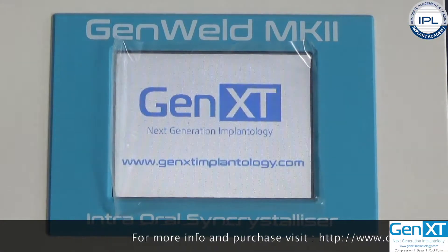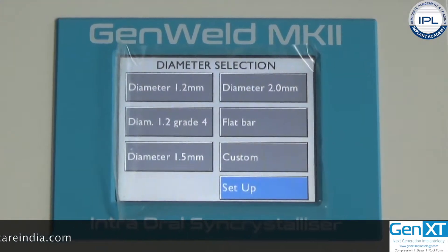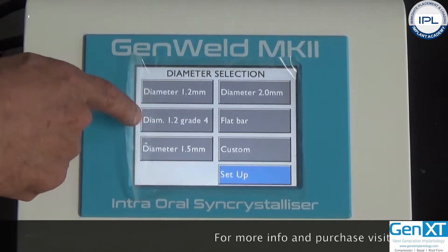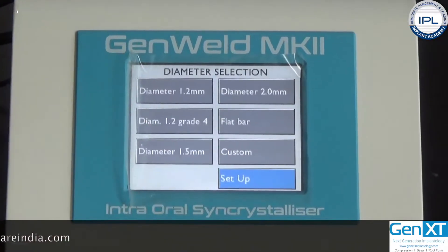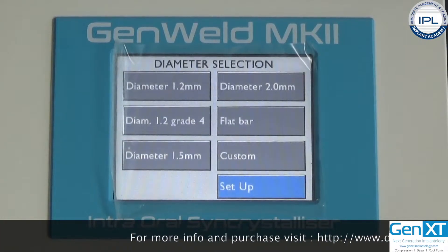Once you turn on the machine, the display comes up asking for diameter selection — whether you are going to weld a 1.2, 1.5, or 2 millimeter bar, or a flat bar. You can also customize the selection and calibrate the machine accordingly.